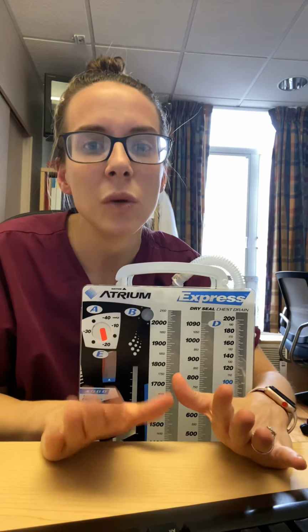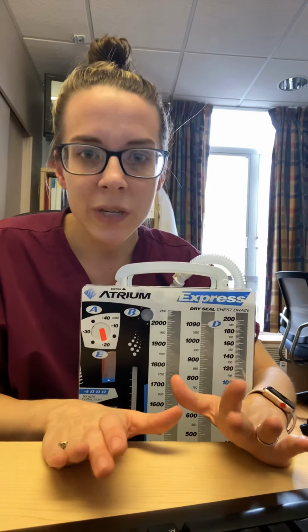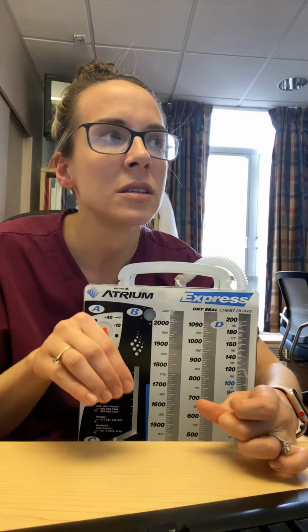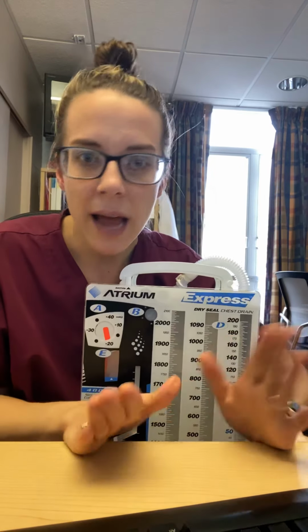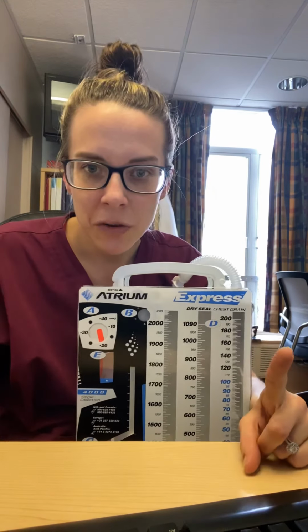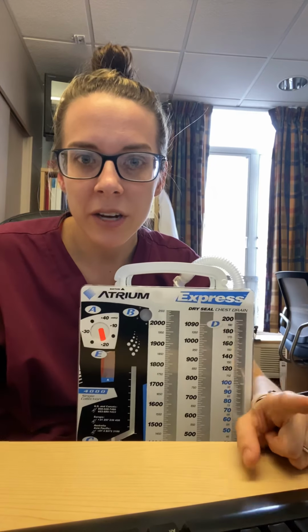But I just wanted to tell you, if you don't see your tube tidaling, don't freak out. You don't need a new tube. It's not an emergency. As long as the patient is not having worsening shortness of breath, is satting fine on room air, and you have good breath sounds, it's probably fine. Again, watch that YouTube video. It'll explain it more. When you're done, come back to me.